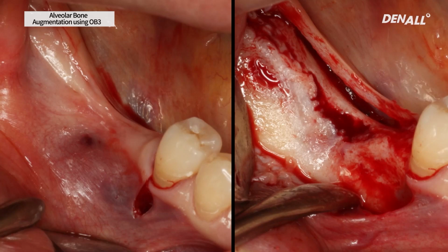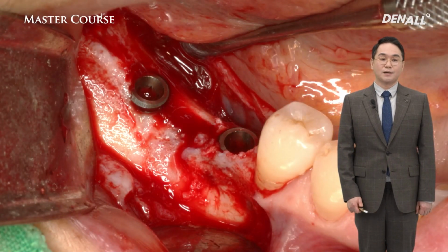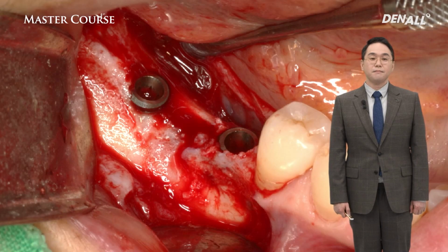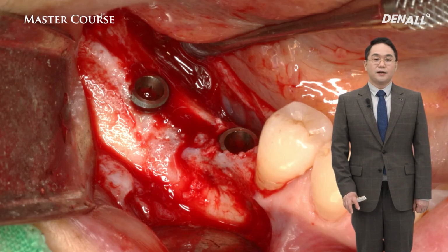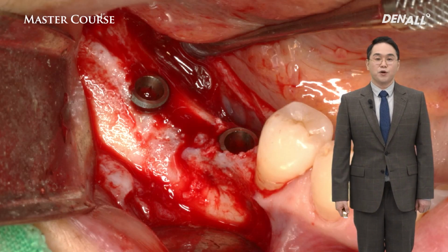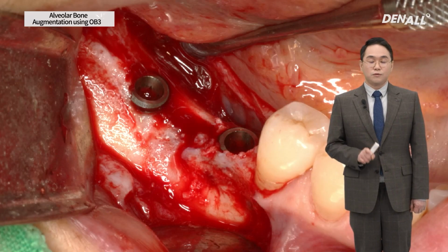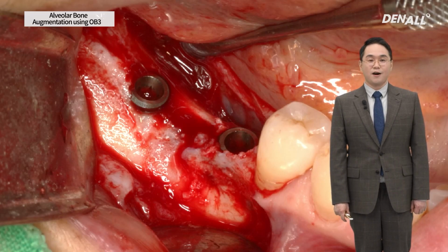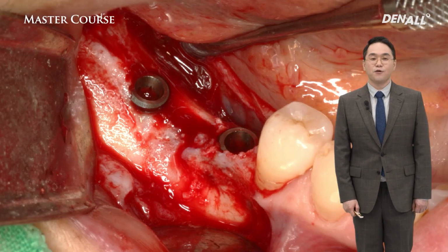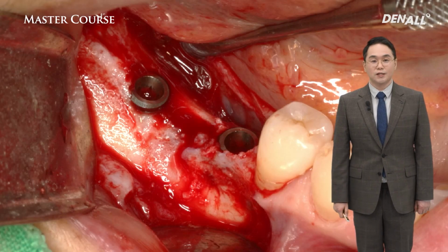But we could place implants in the mandible at number 46 and 47 before performing bone augmentation. So we placed 2 implants at 46 and 47. The vertical bone defect exists between those 2 implants in the mandible. We can use the standard titanium mesh in the mandible, but we decided to use the Jawbuilder to make it easier. So a tenting screw is placed between implants, and the Jawbuilder will be connected to the tenting screw. So over the implants at number 46 and 47, vertical bone augmentation will be done.